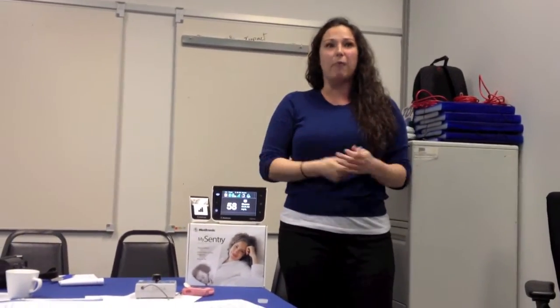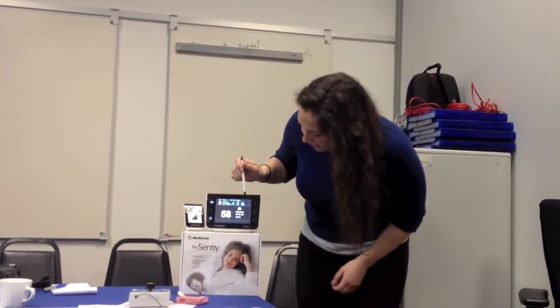So this can be really helpful, especially at night. Say, I want to make sure that I calibrate before bed because I don't want to get an alarm in the middle of the night. Because who wants that? I don't want to wake up. And then you'll also see how many days until you have to change your sensor. So it'll say, okay, you have 1 day left, 2 days, and it'll even go down to hours. So it'll say, okay, this many hours until you need to change that sensor out.